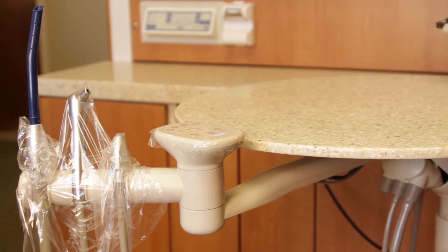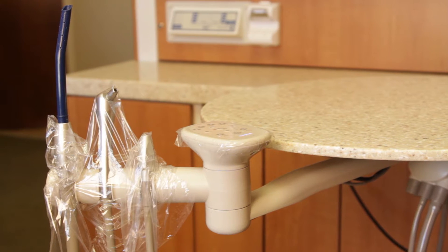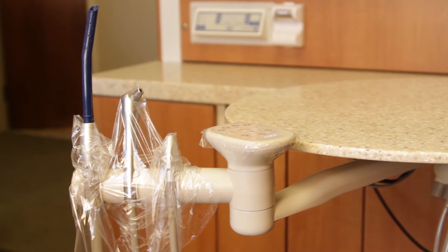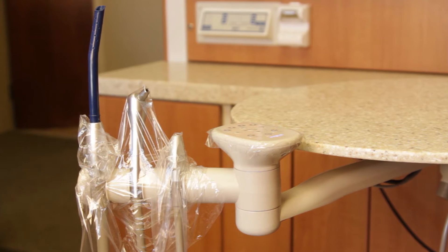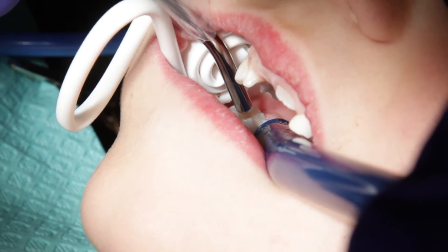Many operatories are set up with a high volume and a low volume suction. If your operatory is set up this way, we recommend you actually move the BlueBoa over to the low volume suction for the sealant procedure. This allows you to use the HVE while rinsing off the etchant.